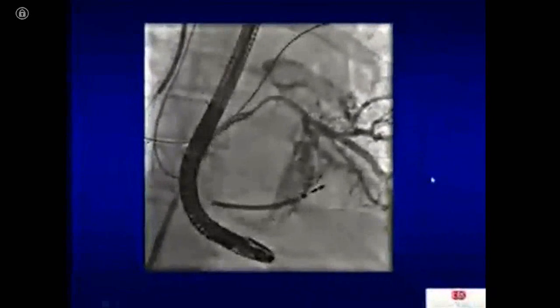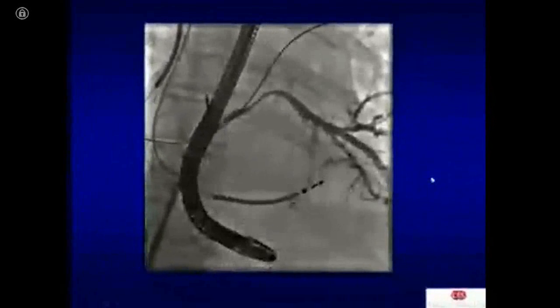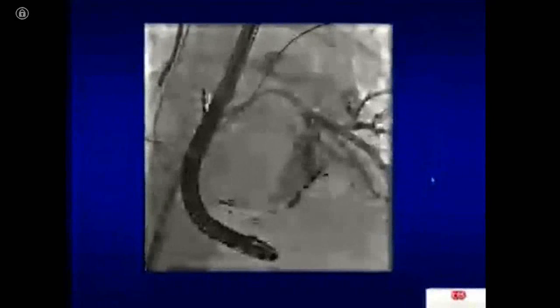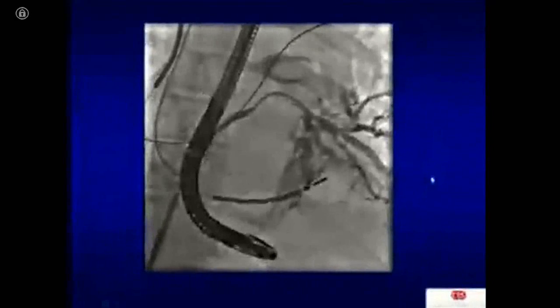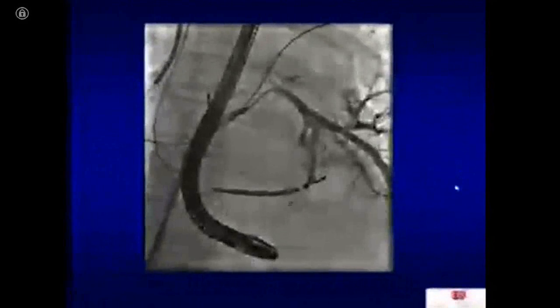I've shown this picture, and then the surgeon was there. He said, Saibal, okay, now we know the thing. Now the patient is stable. Now you've got a pericardial catheter in. The blood pressure's gone up. You've given the blood back. Now we should go for surgery. But I didn't want to give up. My ego was hurt.